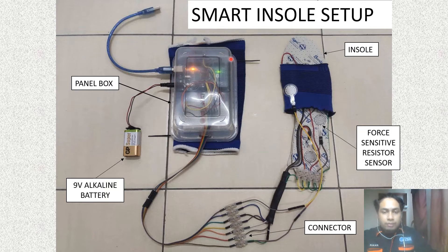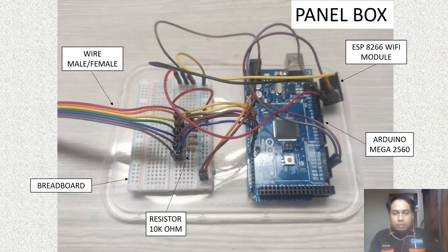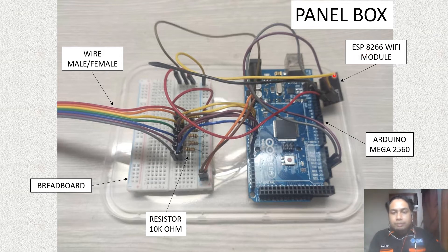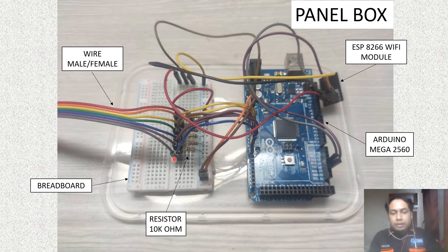This is my panel box. The components inside include: first, the microcontroller, which is the Arduino Mega 2560. Second, I have an ESP8266 Wi-Fi module, which connects to Wi-Fi to transmit data from the hardware to my Blynk interface. Third, I am using a 10K ohm resistor, and also a breadboard with male and female wires.